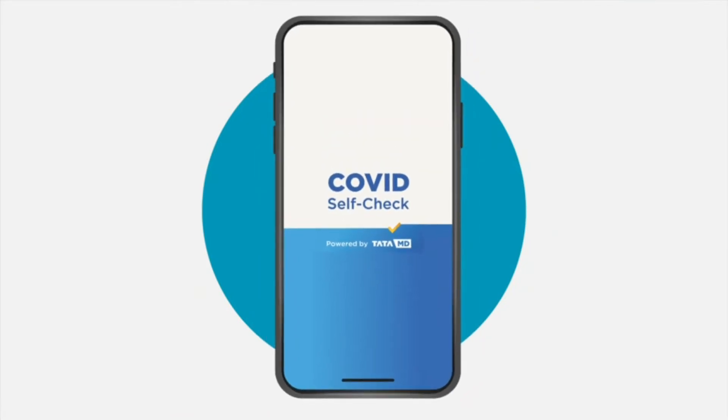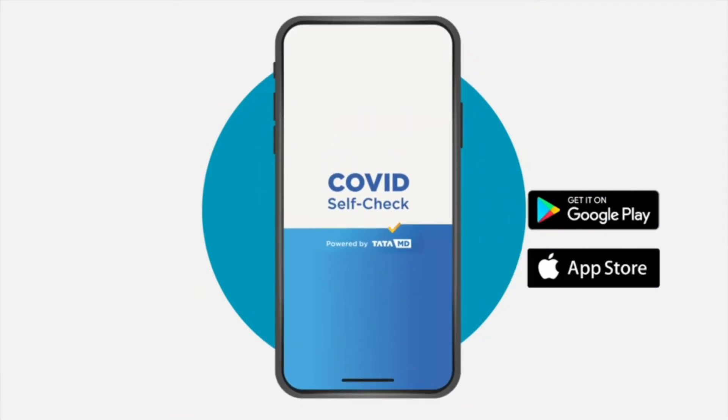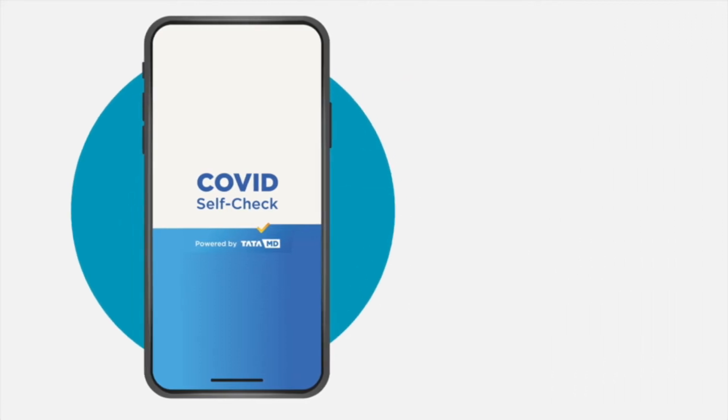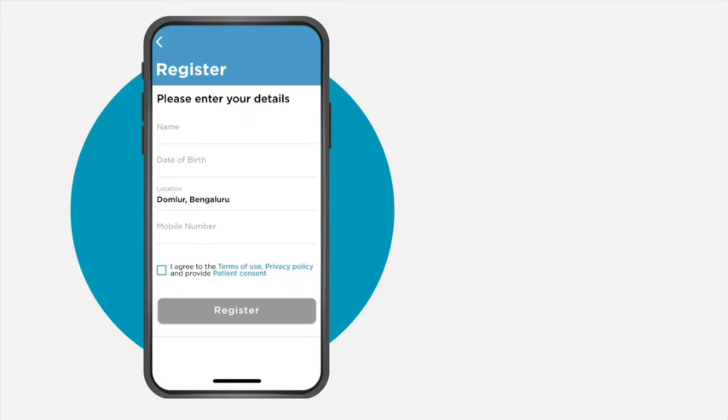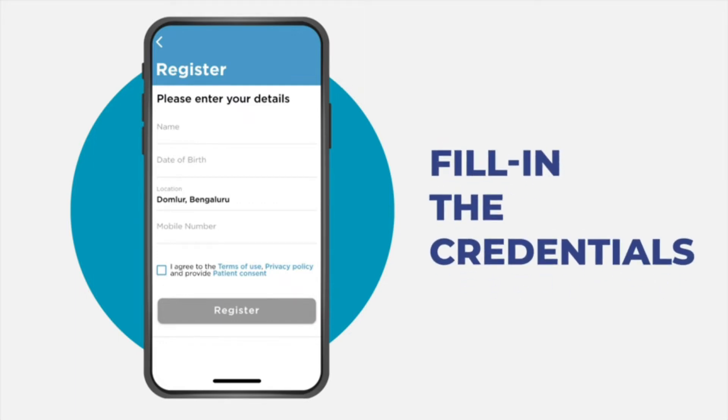First of all, download the COVID Self-Check powered by TataMD from Play Store or App Store on your smartphone. Open the COVID Self-Check powered by TataMD app and fill in the credentials.